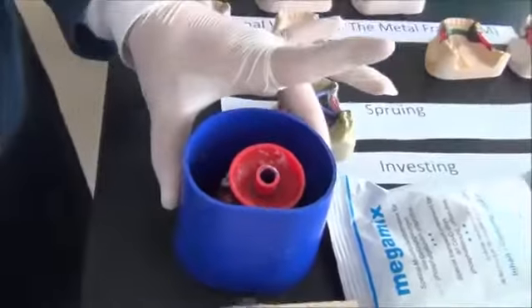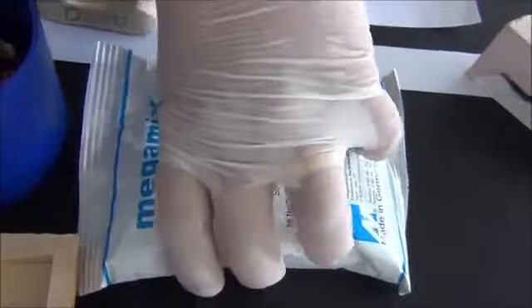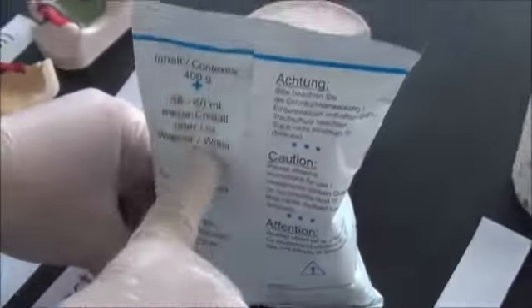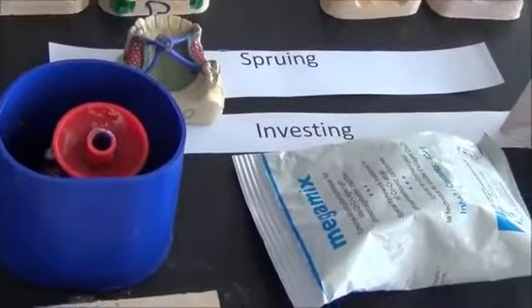Inside this investment ring, I am going to do another pour, but this time I'm going to use investment material. This is the powder, and it could have a special liquid or water, depending on the manufacturer's instructions. These are mixed, and once we have the wet mix ready, we pour it around the material.